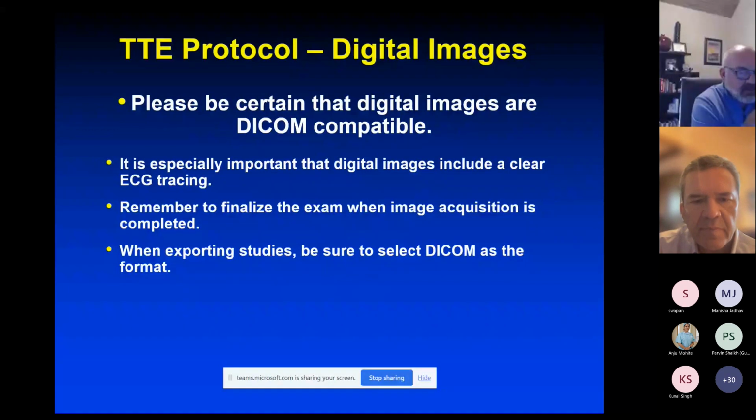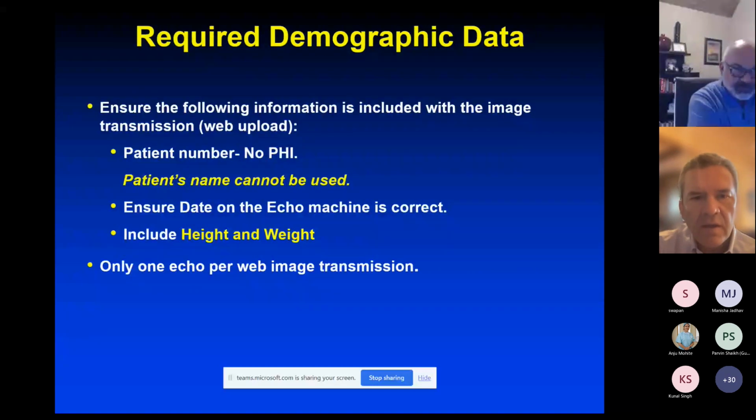And as simple as that may seem, a lot of you on here are also research coordinators who will be in charge of uploading these images, and that has been something that we've had issues with throughout the aortic study. So before you upload, like Brent said, please open the file folders and confirm it's DICOM format, because the machines that are used to read at both Brent's lab and at MedStar cannot open them if it's not DICOM. That makes it more vendor neutral, and we can open it with a variety of software packages.